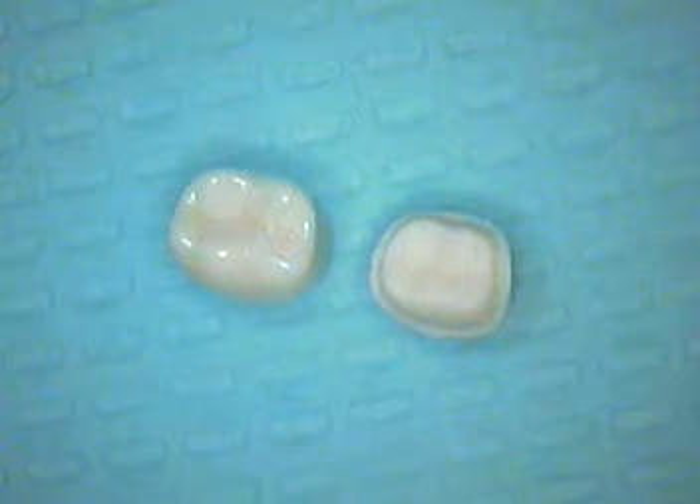Hello and welcome back. This is Dr. Jerry Cuomo with the full crown preparation design on tooth number 30.